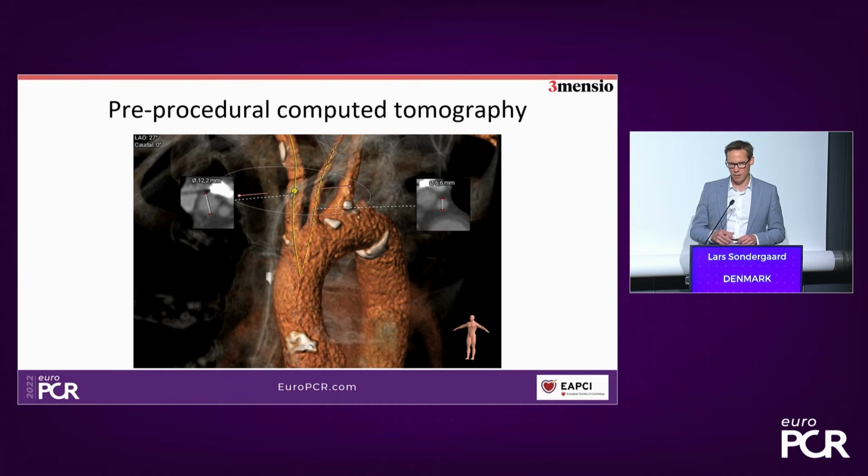One of the things I think that we forget very often when we're imaging for TAVI is to look at the aorta, not just the arch as in this image, but also look at the descending aorta, because you can have surprises there that could alter either your decision to do a TAVI in the first place or indeed the type of valve that you would choose.